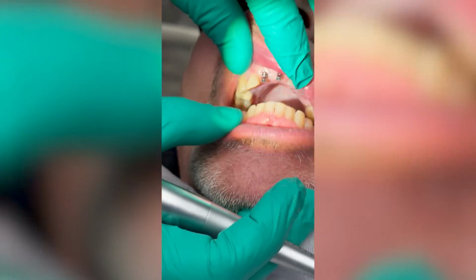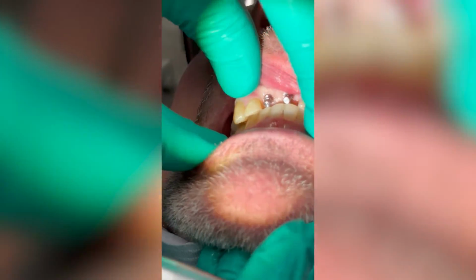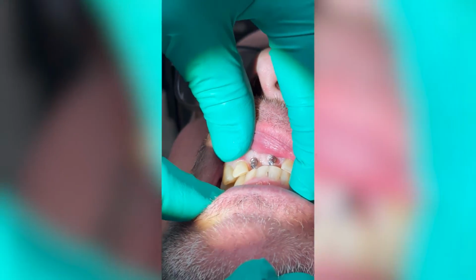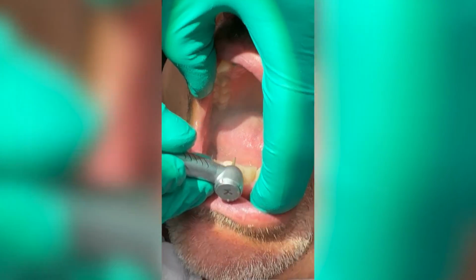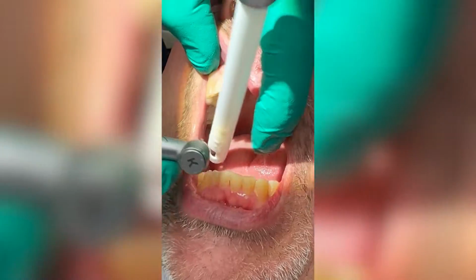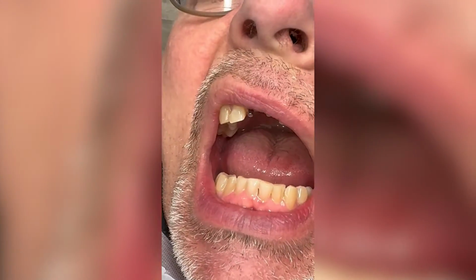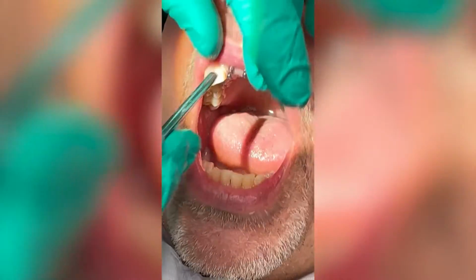And close again. And that gives us just enough space for porcelain. And maybe just a tiny bit more on this too. Okay, so those 2 implants are ready to go. And now we're going to do the other 2 on number 12 and 13.